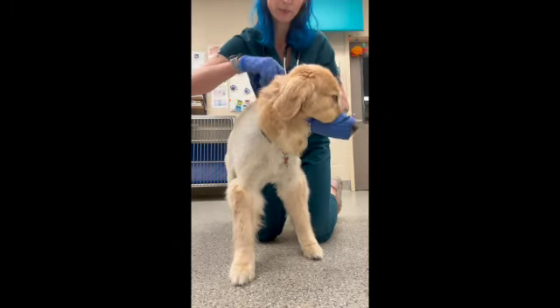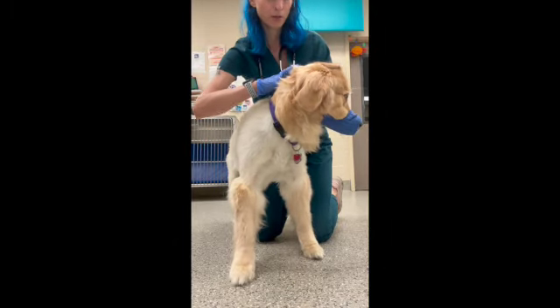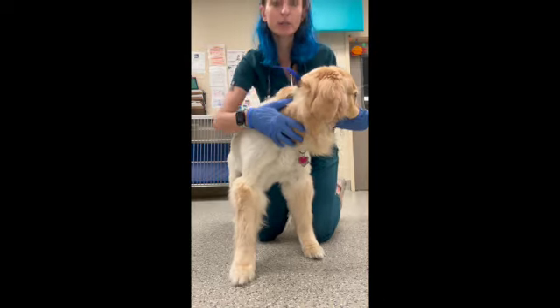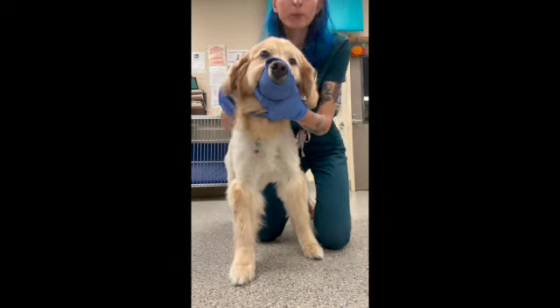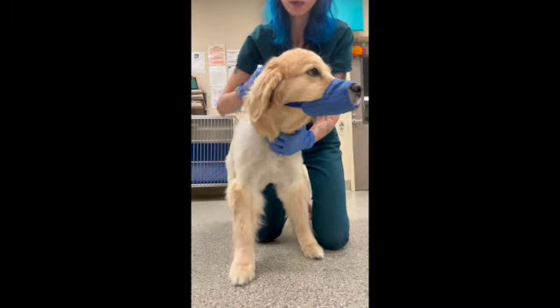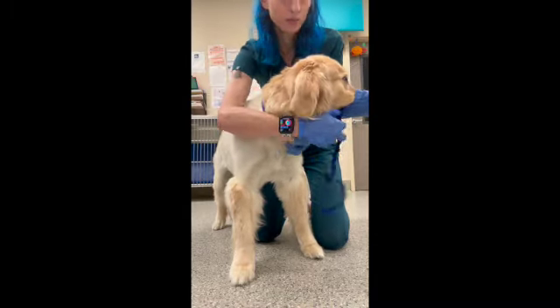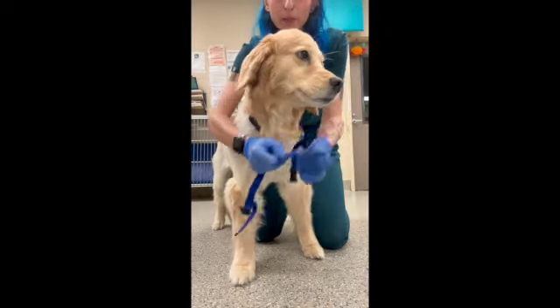You want to secure it behind the ears, clasp it, and make sure it's nice and tight and that your patient is not able to open their mouth or get it off by sliding or it being too loose. And then you can just take it off, like so.